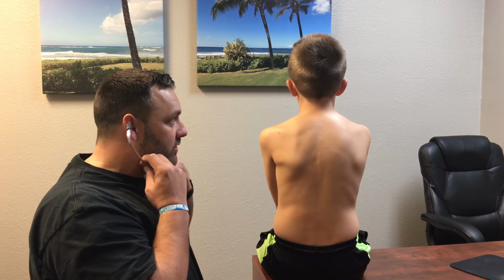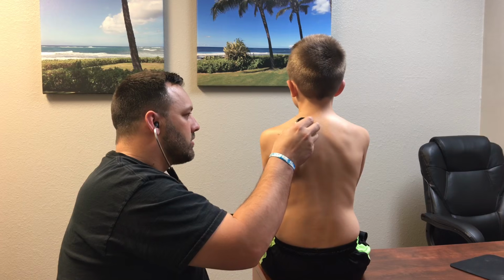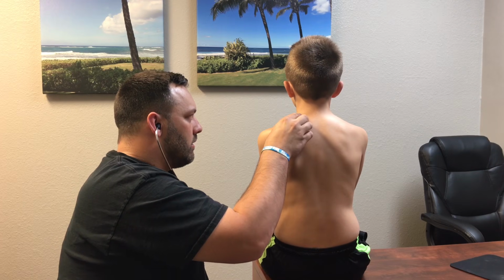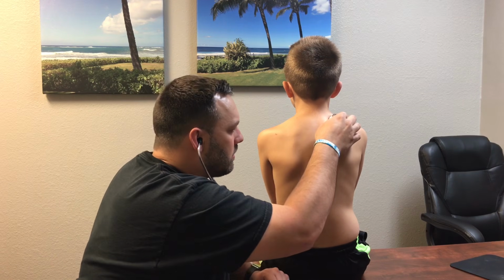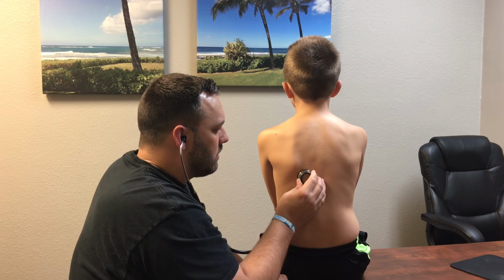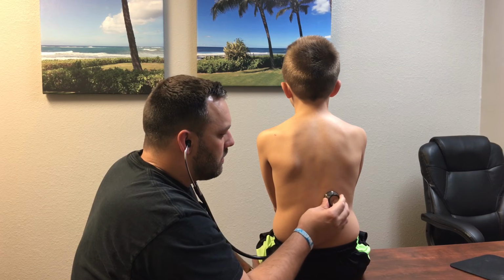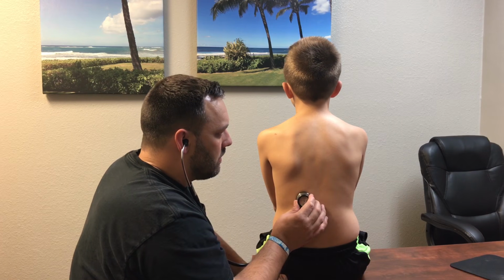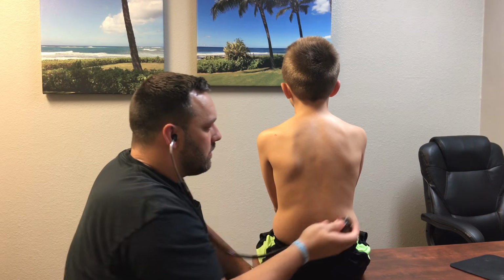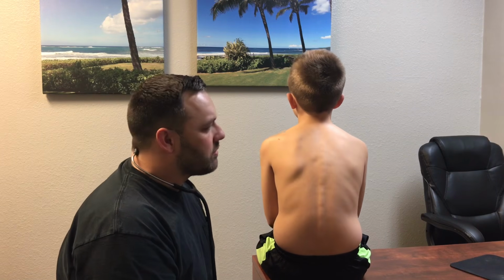So last one, let's do egophony. That's going to be the E's. Do the same thing: just say E when I touch the stethoscope to your back. Go ahead. E. E. E. E. Okay, all right, so same results there as the previous assessment.